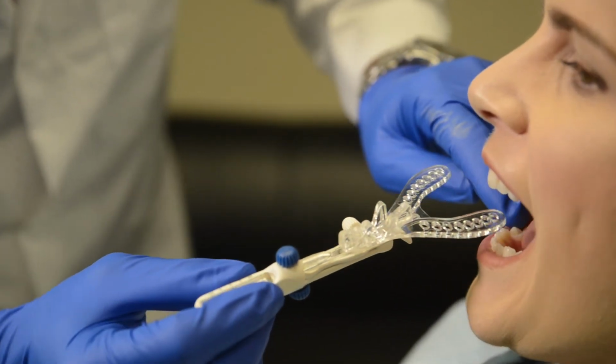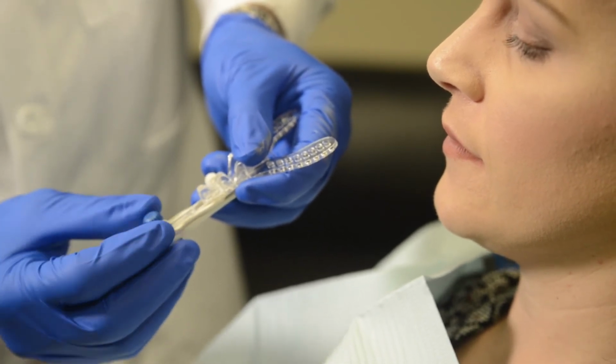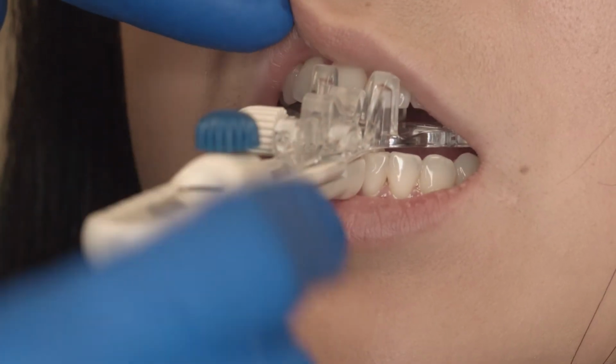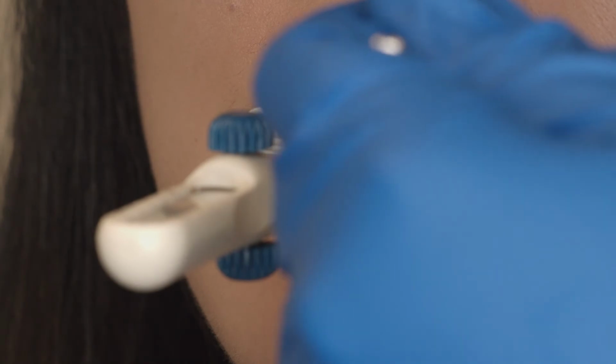Remove SOMGauge from mouth and secure at the desired starting position, such as 2/3 between the centric and full protrusion settings. Reinsert the SOMGauge over the skeletal midline as before, and instruct patient to gently reclose into established protrusive position.